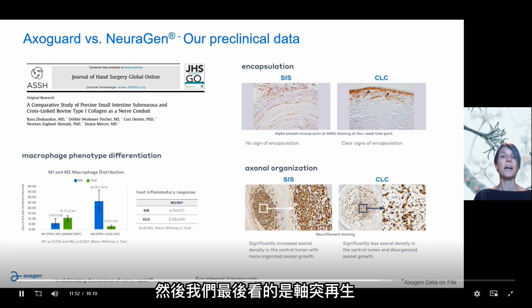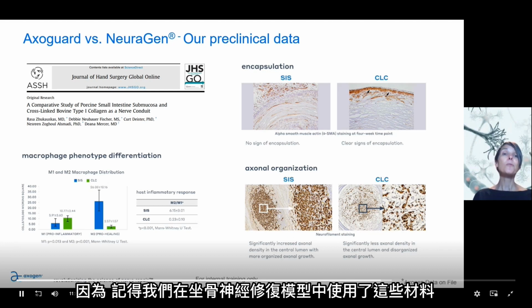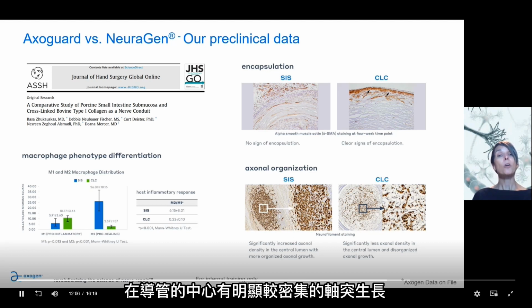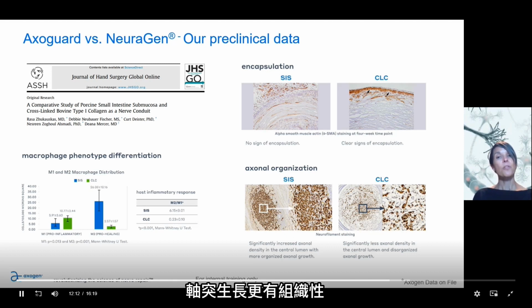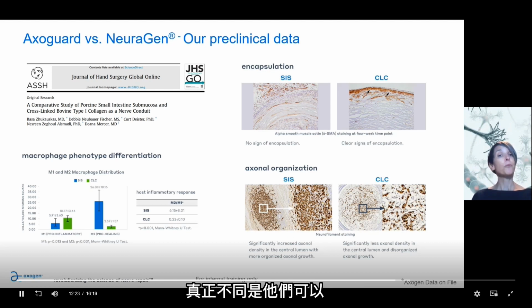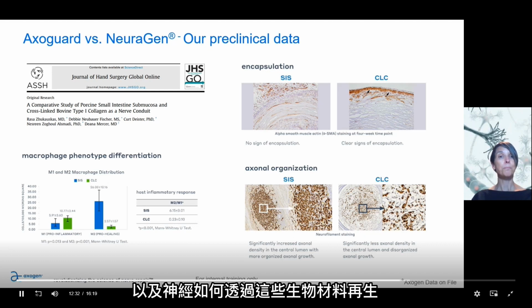And then the last thing we looked at was axon regeneration, because remember, we use these materials in a sciatic nerve repair model. And what we found is that the SIS material had a significantly more dense axon growth in the center of the conduit and more organized axon growth compared to the collagen material. So really, this study highlights the importance of biomaterials in nerve repair and the real difference that they can make in how the body responds and how nerves regenerate through those biomaterials.